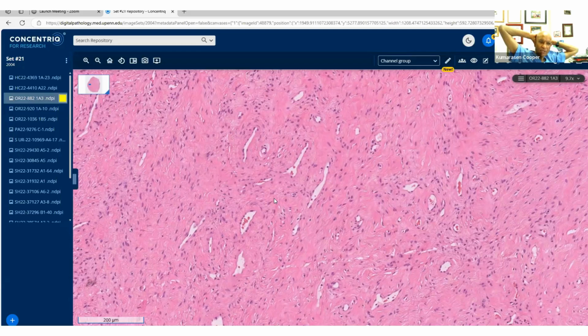You know, out of all the markers we mentioned, I know you've got an S100 and I know you have Desmin and CD34 and you have Actin, so you have some to work with. You don't have RB1. You don't necessarily need that, but it's useful. But what you should get is MUC4 out of all those that we've talked about so far today.